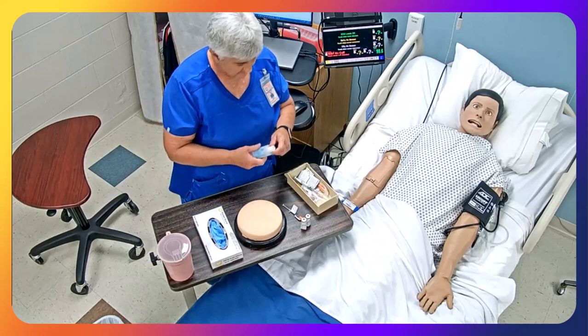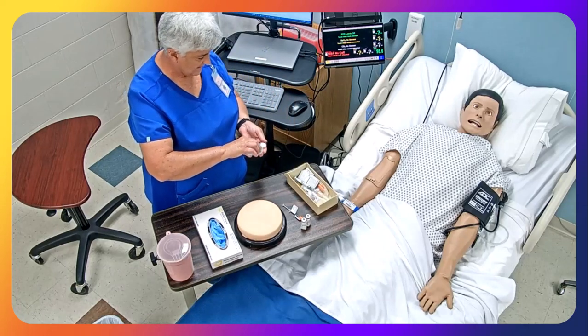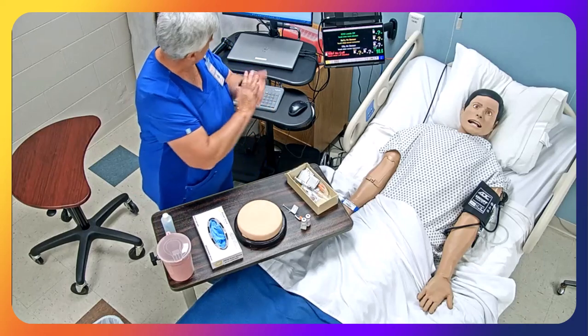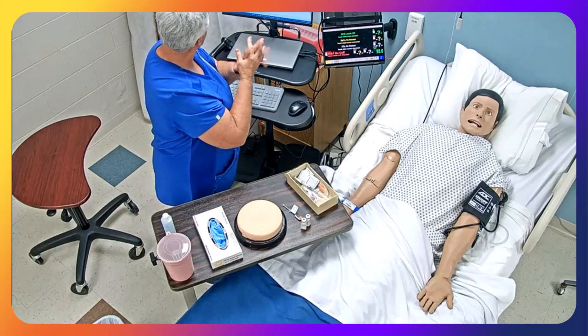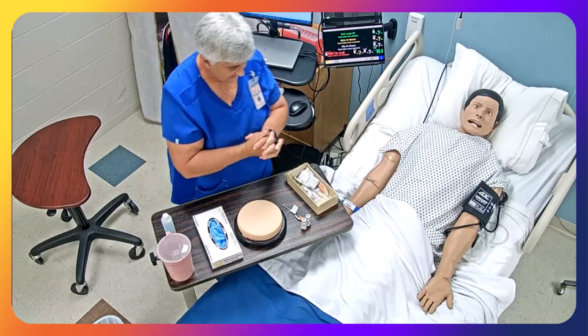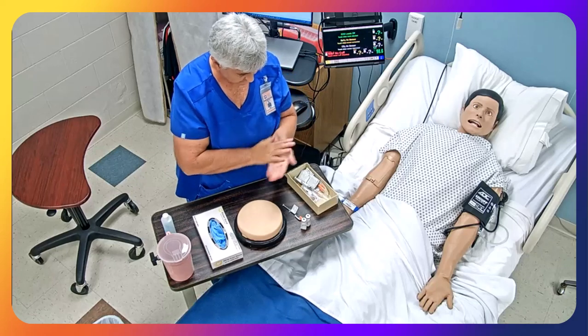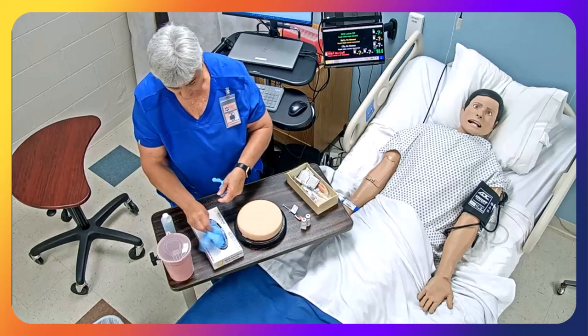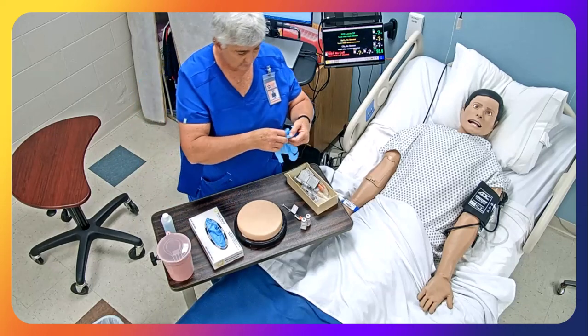Okay, so I'm going to go ahead and wash my hands again real quick. Okay, so we scan that medication, we scan the armband, make sure we have the right patient for the right med. We've done our teaching. We're going to go ahead and always make sure we have gloves on when we give an injection.